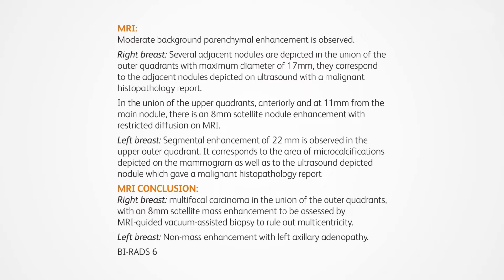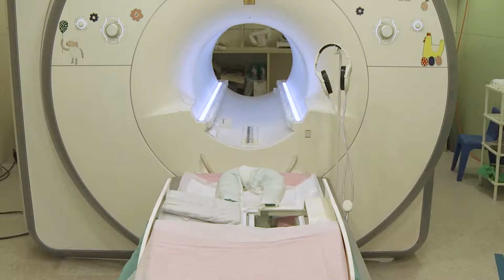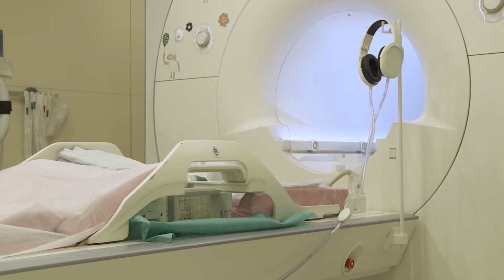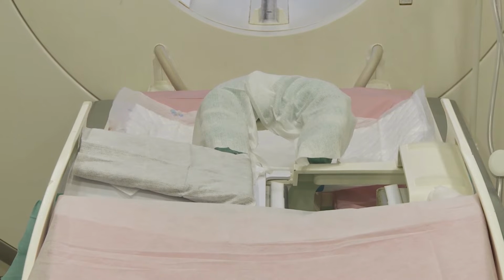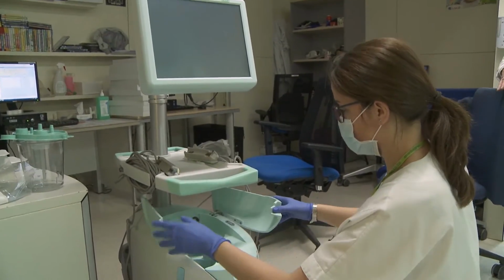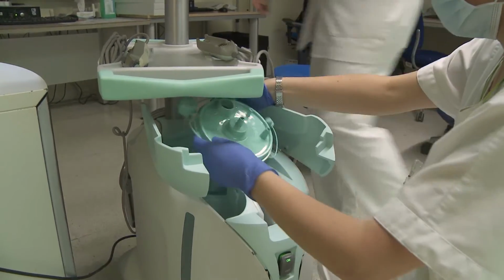Several MRI biopsy exams are scheduled for the day. MRI acquisition system and all material needed for the biopsy is prepared in advance. Dedicated MRI breast biopsy coil, grid compression kit, pillows, pads, cushions for patient comfort are in place. EnCor console is set up with the canister, cassette and saline.